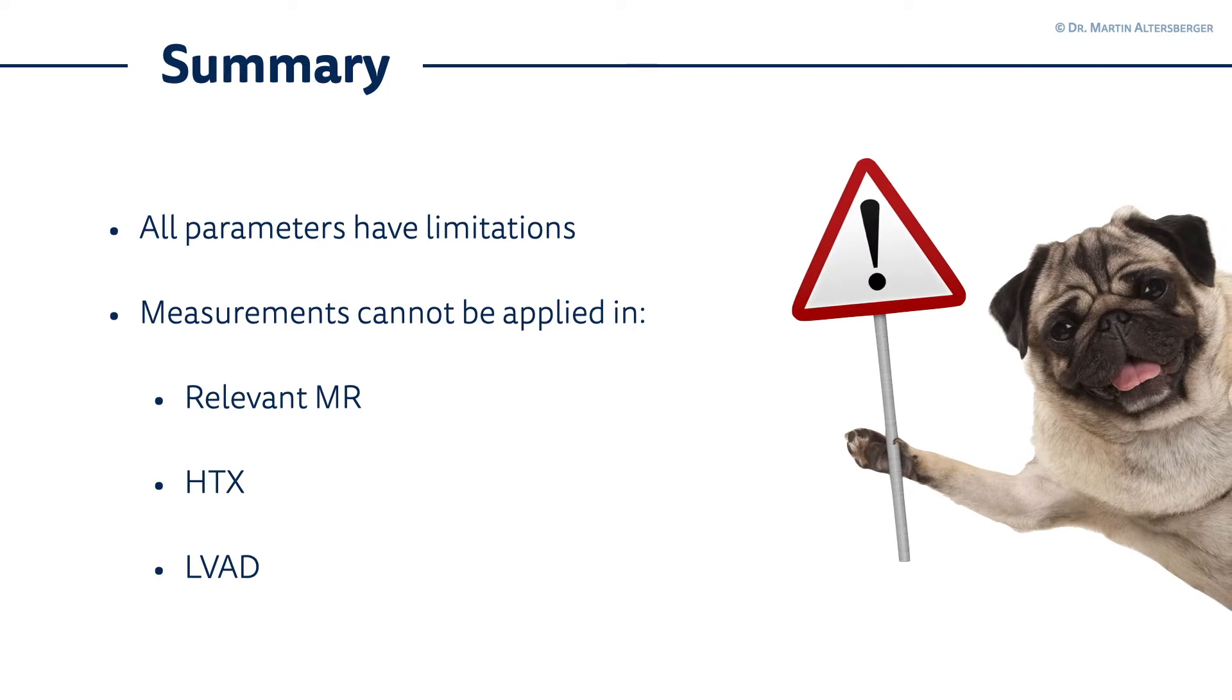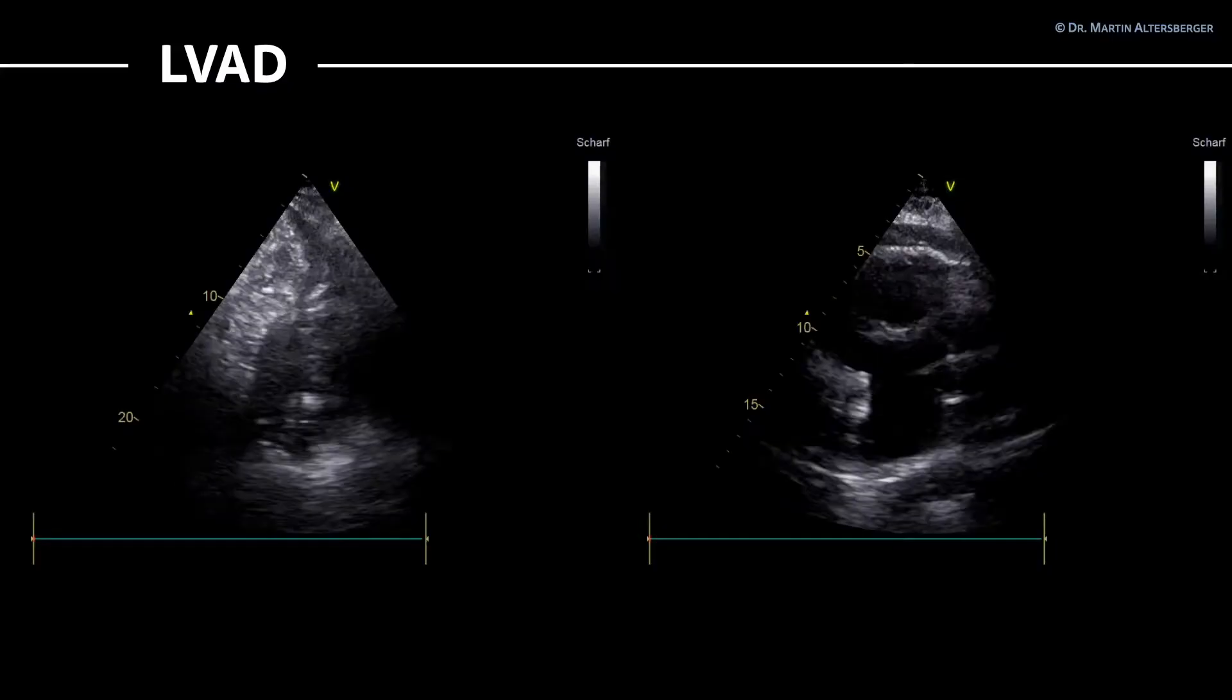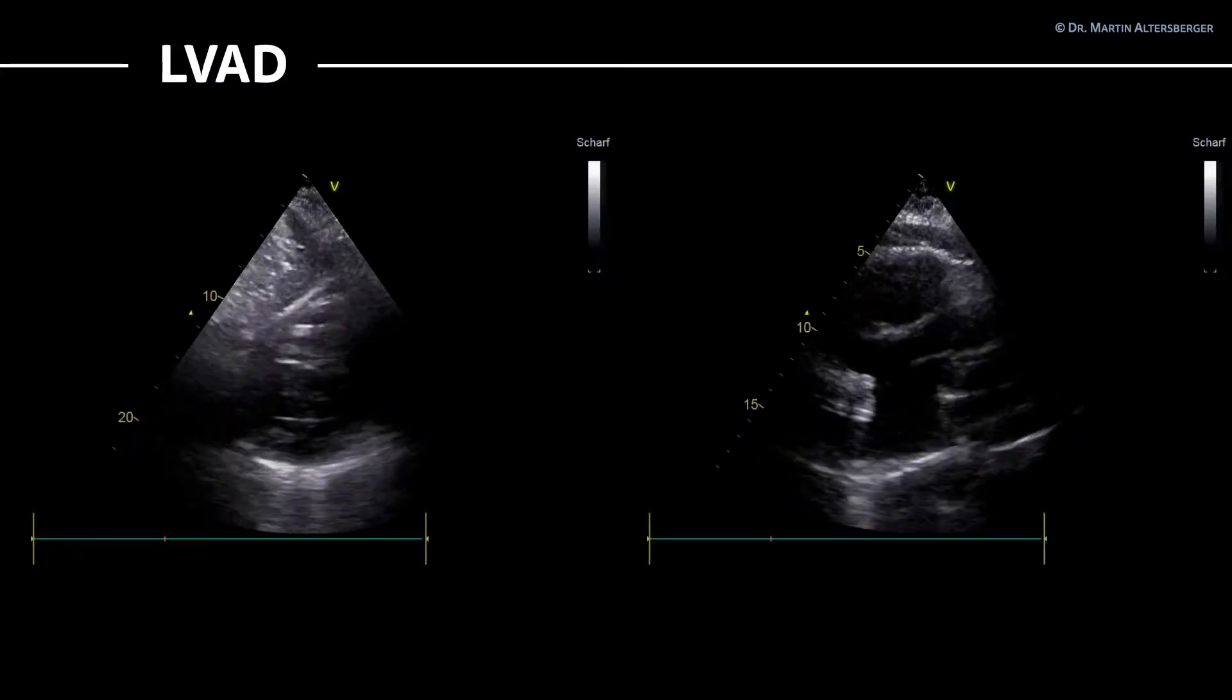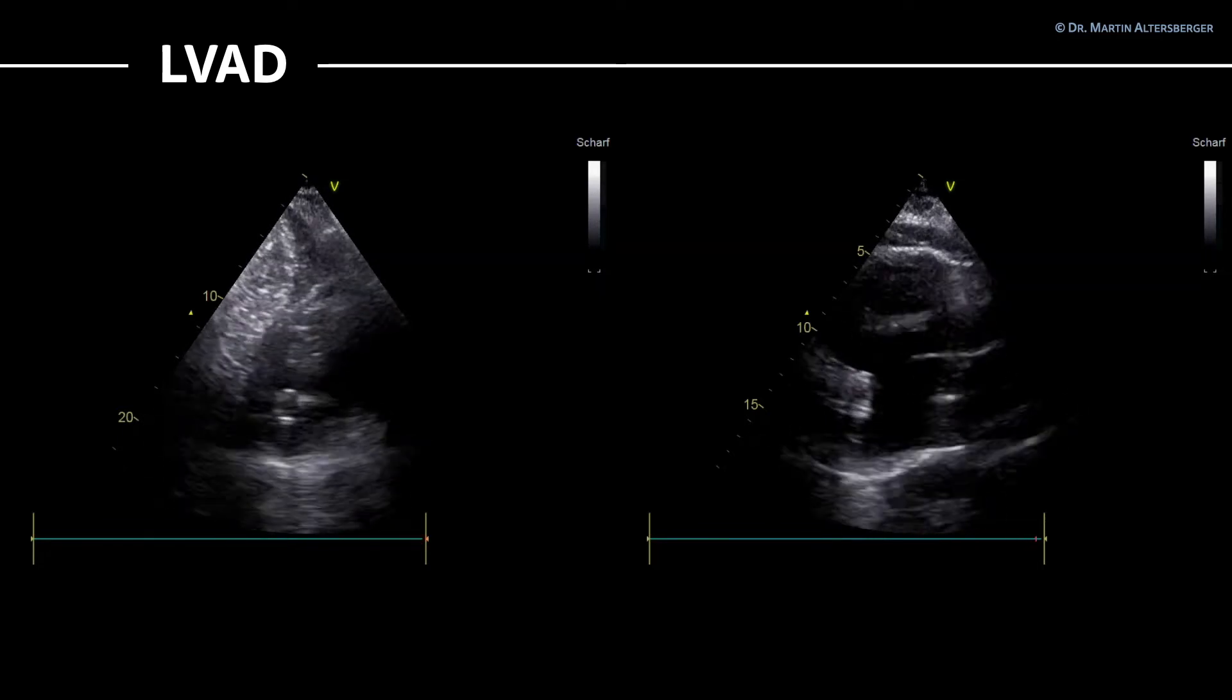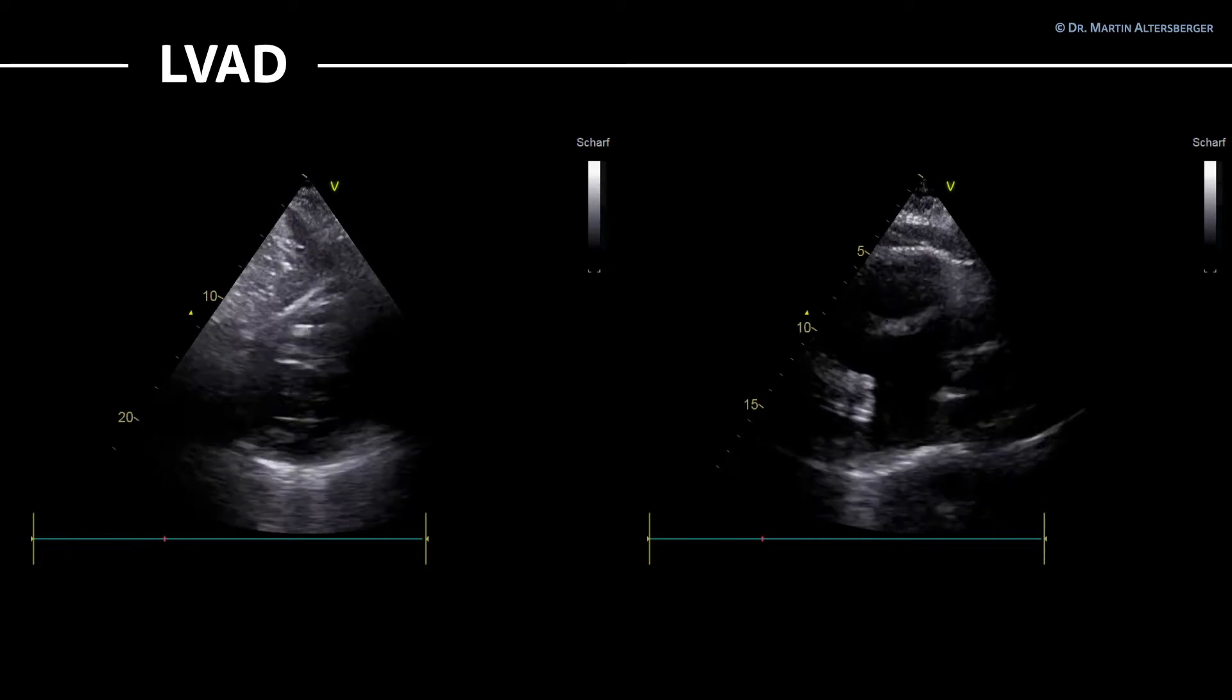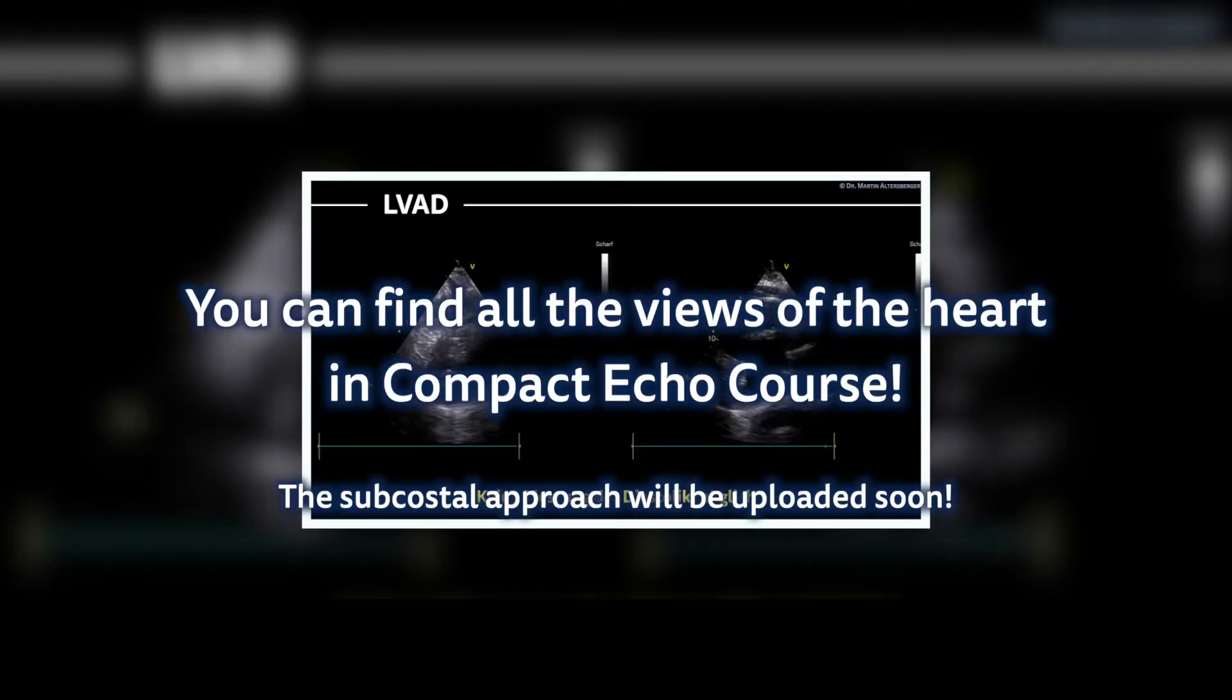The next situation where you cannot apply the measurements is in patients with a left ventricular assist device. How do you know that there is a left ventricular assist device present? Left ventricular assist devices are used in heart failure patients. In this case, you see a short axis view of the subcostal approach of the heart. If you want to know how to perform subcostal views - not only the four chamber view - in the compact echo course, you will find videos about the subcostal approach and all other views of the heart as well.